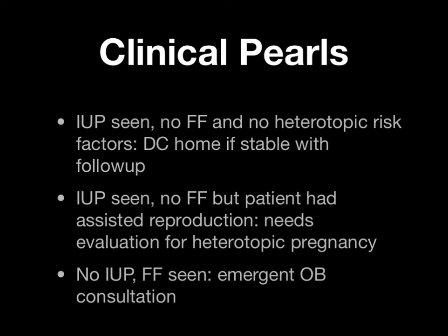What if you don't see an intrauterine pregnancy and free fluid is seen? Particularly if you see free fluid in Morison's pouch, these people need emergent obstetrical consultation. They should be considered to be a ruptured ectopic pregnancy with hemoperitoneum until proven otherwise.